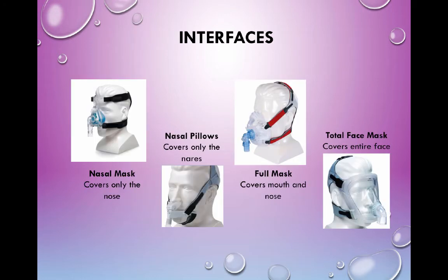And here's why. We have all these different interfaces. The first two, the nasal mask and the nasal pillows, are the ones patients are most receptive to. One covers just the nose. It looks almost like your resus mask. And then the nasal pillows are just that: little discs that sit right in the opening here. The patient's mouth is exposed, so they can still talk and all those kinds of things. They're a little bit more comfortable for patients. The downside is their mouth isn't covered. If they breathe through their mouth or hang their mouth wide open, it may not be effective because all the gas will leak out instead of supporting their breathing.